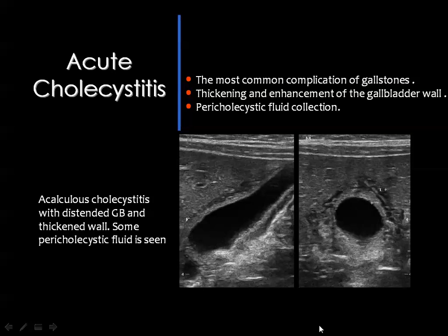the xanthogranulomatous types. Acute cholecystitis means that there is acute inflammation of the gallbladder, and we have major or important findings by imaging. Number one is thickening of the gallbladder wall. You remember the normal thickness is about 3 millimeters, but here it may reach 1 centimeter in some cases. Then number two, you get some fluid around the gallbladder. We call it pericholecystic edema, and you may see inside the gallbladder some mud or some calculi.